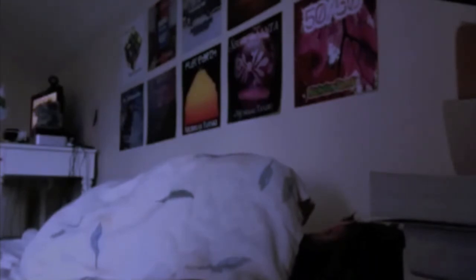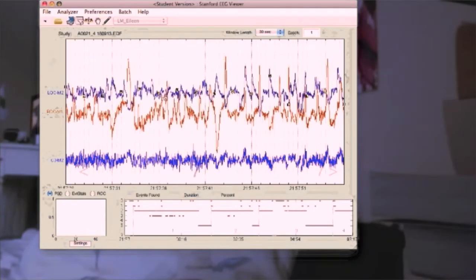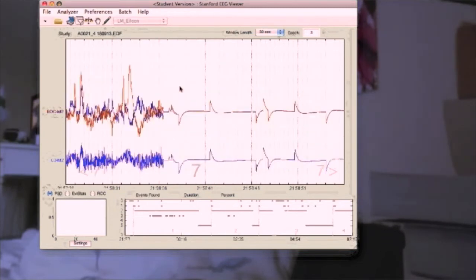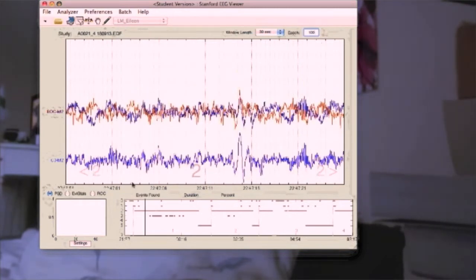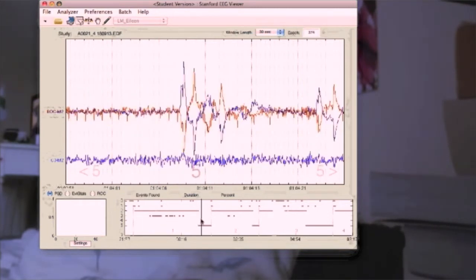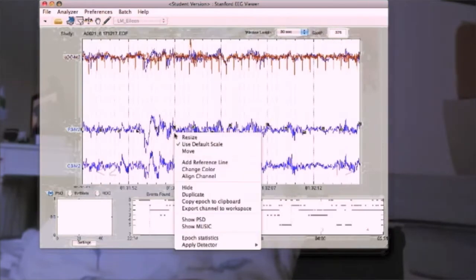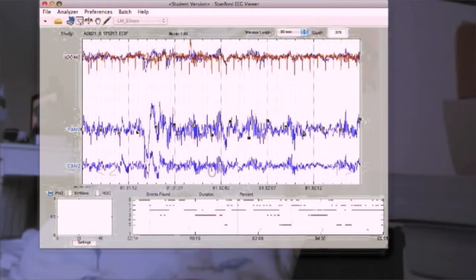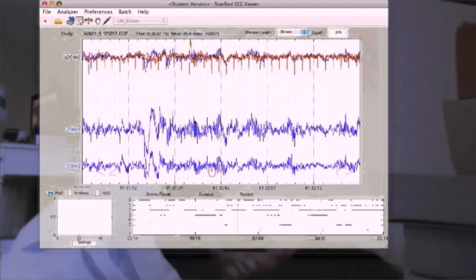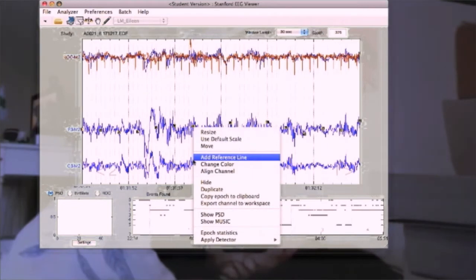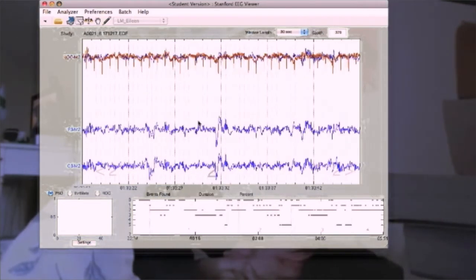The SEV provides a graphical user interface that lets users easily load signal data that has been recorded during nocturnal polysomnography studies. This sleep data can be moved, resized, and directly manipulated in a variety of ways to suit the user's visual preference.